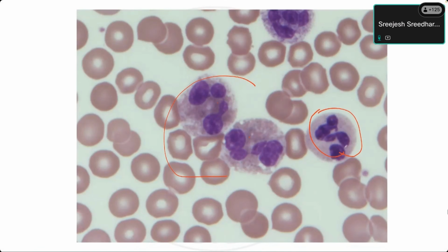But remember that they are the normal ones. But when there is a reaction, the eosinophils can have 3 or 4 or 5 lobes. Even single lobes can also be seen. So the characteristic feature is the presence of these kind of orangish granules. The bilobation or these two lobes are given less importance compared to the color of the granule. So these are eosinophils and this is a neutrophil.